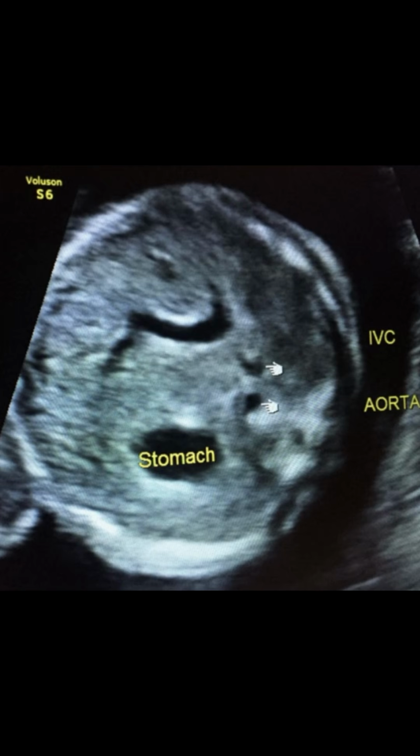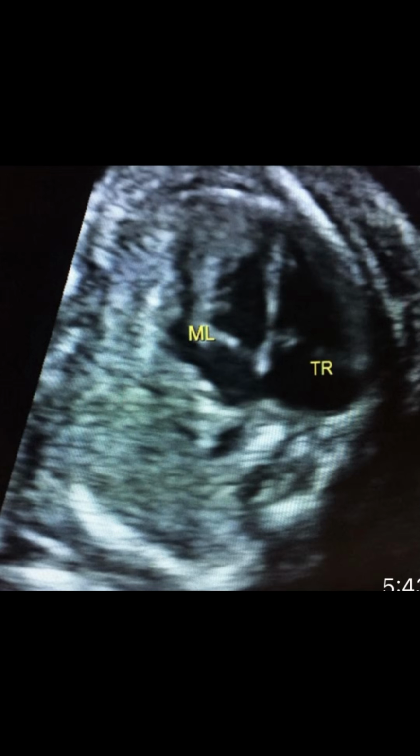The abnormal visceral situs with the aorta and the inferior vena cava are both to the right of the spine. In this case, we can presume that the heart could be in the right hemithorax, so you can start looking for it there. And it is confirmed.